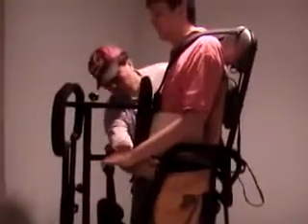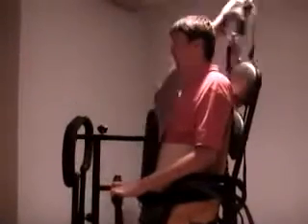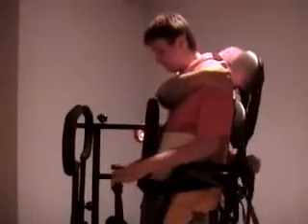Depending on your level of injury, there is a right standing frame for you. When it comes to my particular level of injury, I need a specific standing frame that will be able to support my height, my weight, and my balance. Discuss with your physical therapist which standing frame is right for you. They will be able to ask the right questions and address the right issues and find you the right standing frame. It is also a good idea to try the standing frame out before you purchase it.